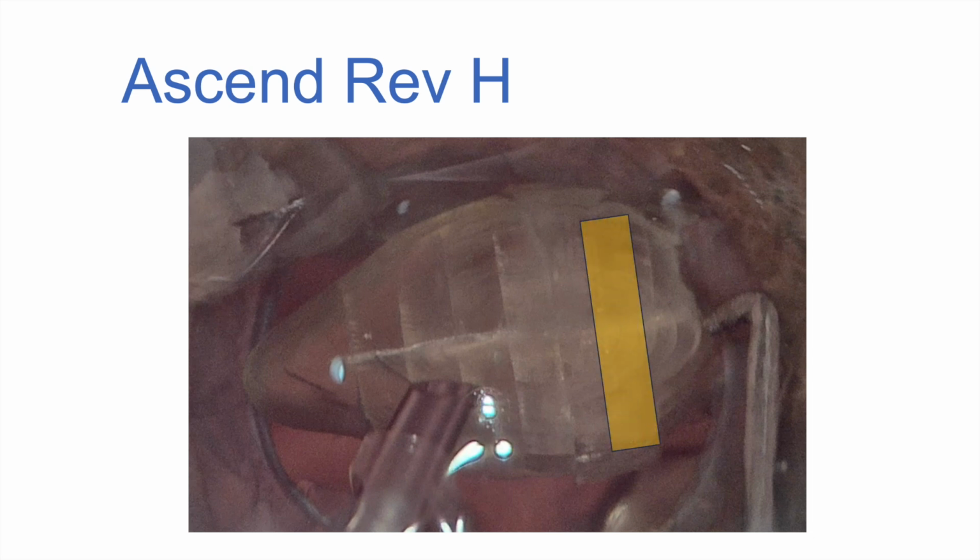Here's a nucleus that I was able to bisect and take a picture of. You can see the horizontal cut nicely here. And what's happening is you no longer have these long pieces of nucleus. We now bisected it, so I say it's like we went from French fries to tater tots. But it's much easier to remove these pieces because they're cut in half, so the surface tension isn't as much.